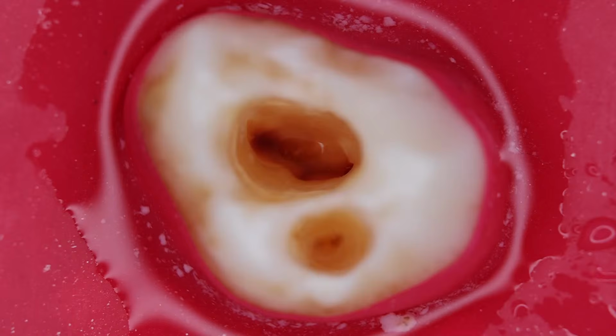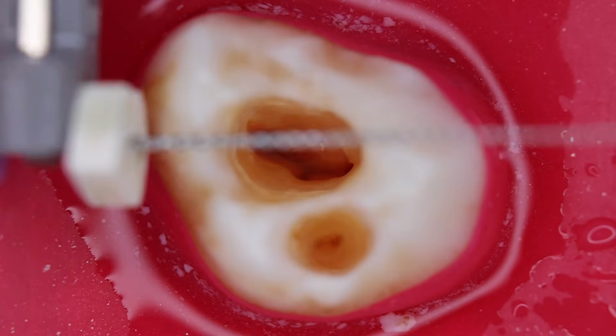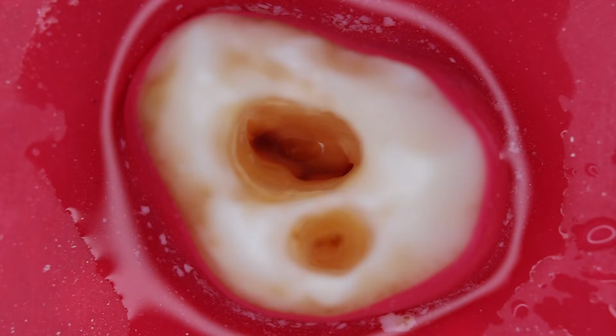So this was the demonstration on how you determine the working length with the help of an electronic apex locator. After you determine the working length, reduce that length by 0.5 to 1 mm from whatever length is shown by the apex locator, and then introduce the gauges or whatever, so that you can clearly visualize the orifices over here. So in the next session we will begin with the cleaning and shaping of these root canals.